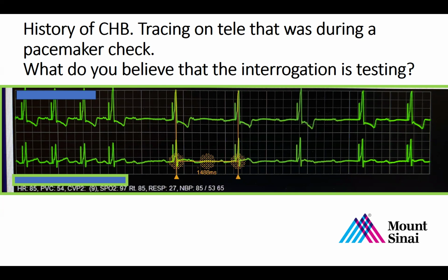Right. So remember always there's two major functions pacemakers do, right? One is that they pace, hence the name pacemaker. And the second is that they sense, right? If the patient has their own intrinsic rhythm, a pacemaker has got to sit back and not do anything. So you need to be able to sense, particularly in a dual chamber pacemaker and somebody who has normal sinus node function. It's very important that the atrial lead can sense well, because chances are in somebody who has isolated complete heart block but otherwise has normal sinus node function, it will likely be A-sense V-pacing almost exclusively. So when you look at the counter, it'll be like 99% A-sensed, 100% V-paced.